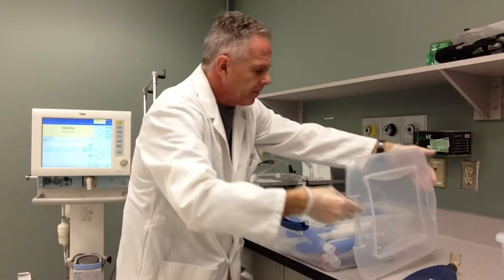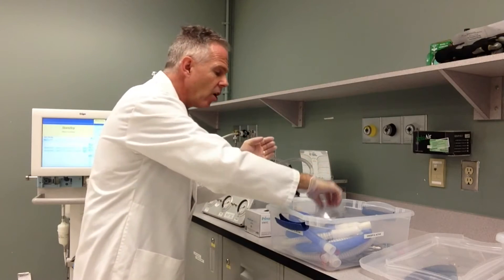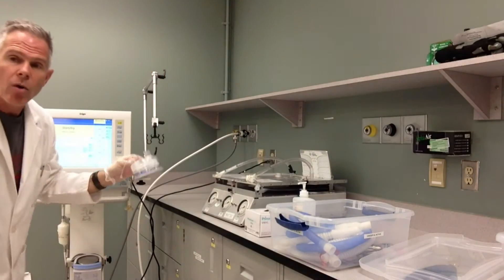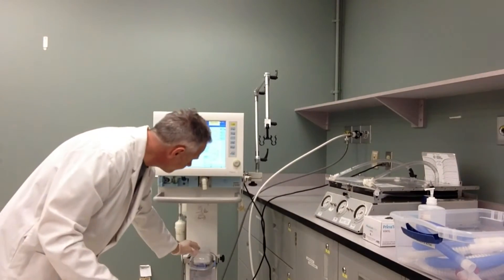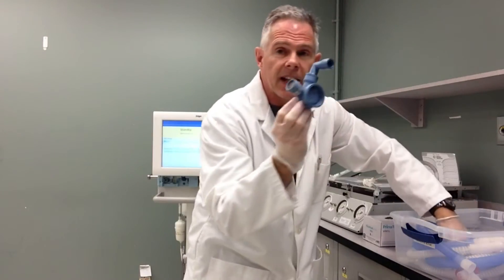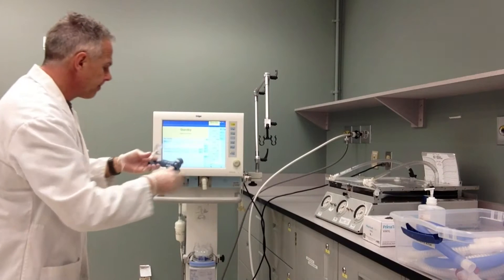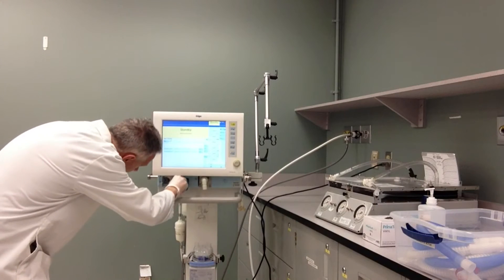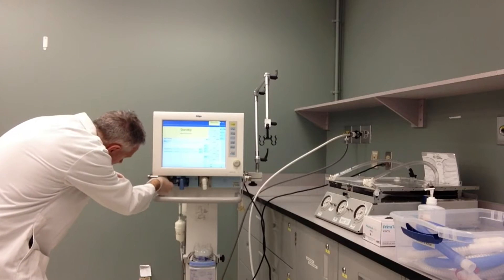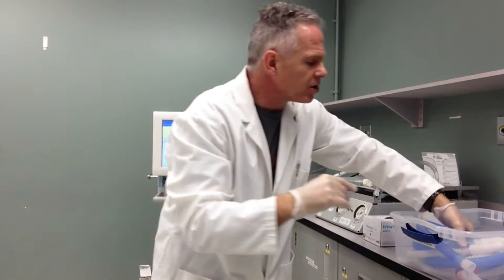I'm going to open up. With a heated circuit there are a lot of components, so you have to develop a little bit of a strategy. One of the things I do is put on the heated humidifier pot first thing — we can do that right on our ventilator here. You'll notice I'm not touching any components but the circuit components. With the Evita ventilator, I also have a couple of unique components to put on: the exhalation valve and the flow sensor. Those simply click into place, just like this. I don't have to touch anything else except those components while doing that.